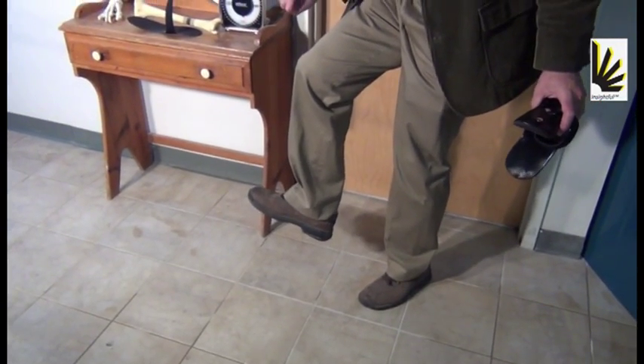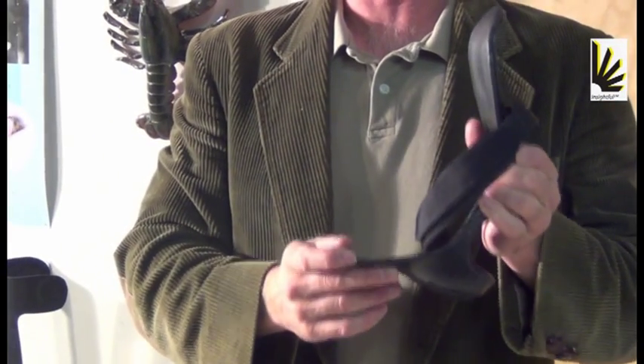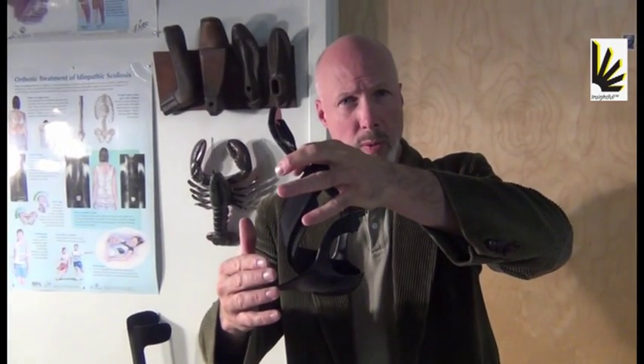Our design is specifically designed for Dropfoot and addresses and controls only the parts of the deficit that you need to control. This design is specifically designed for weak dorsiflexors — the dorsiflexors are what bring your foot up, and that provides both clearance and shock absorption during heel strike. Our design has a posterior section for weak dorsiflexors. It does not have a rigid anterior tibial section because for Dropfoot, you don't need it and it's not desired. This approaches the problem from the back, making up for the weakness of the muscles in the front. This replaces that by decelerating the foot at heel strike and then bringing up the foot for clearance during swing phase.